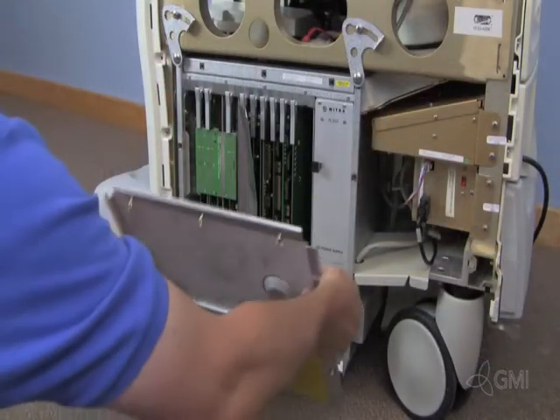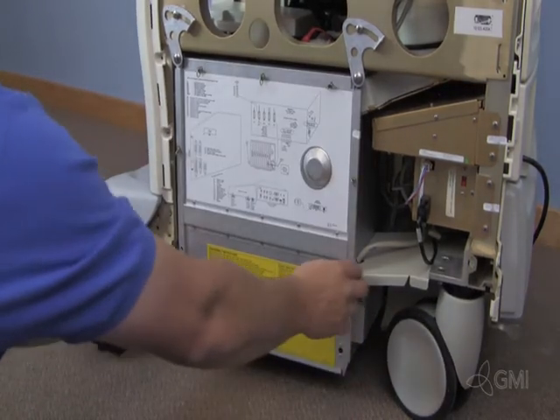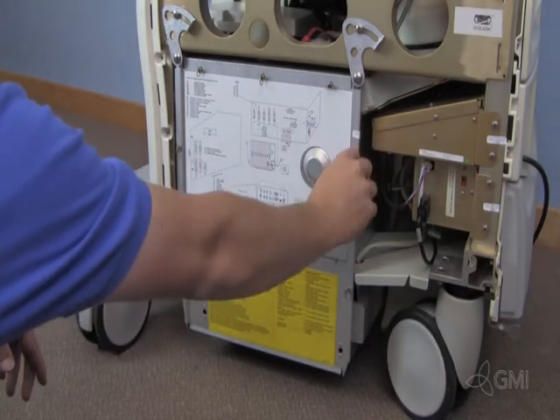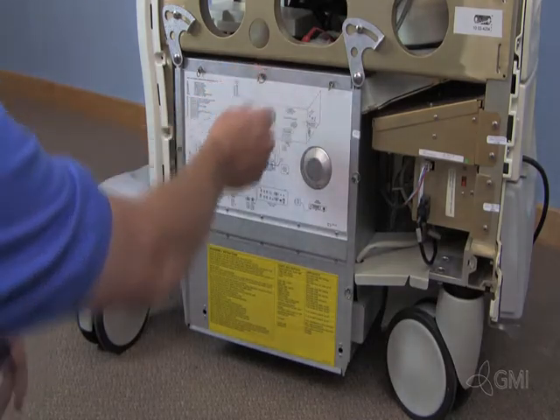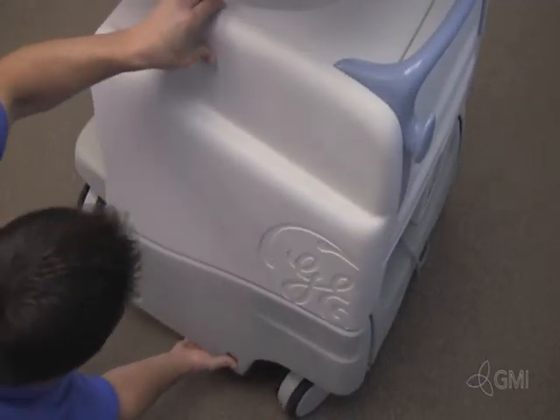Reinstall the card cage cover. Reinstall the screws to secure the card cage cover. Reinstall the right side cosmetic cover.